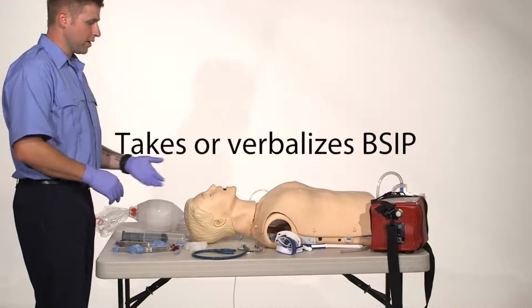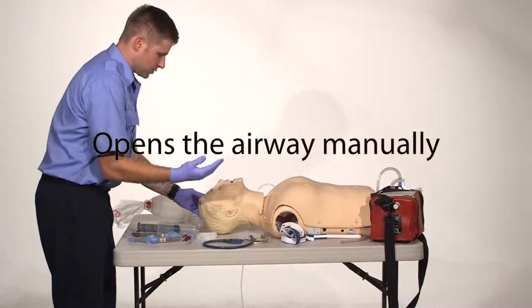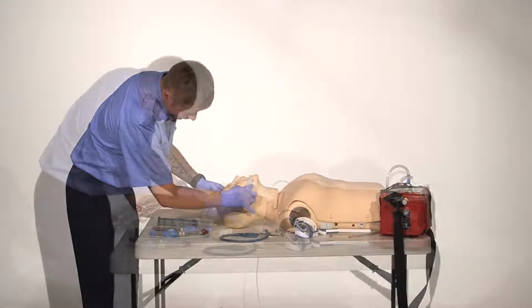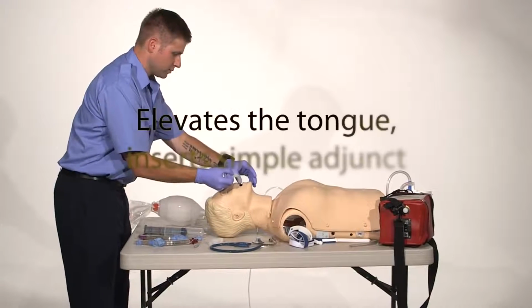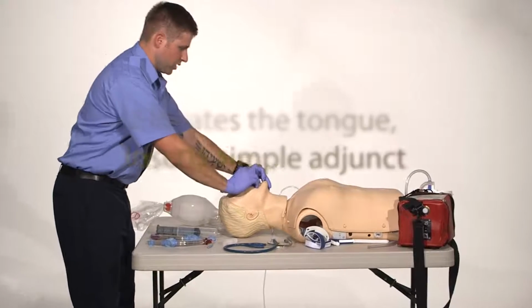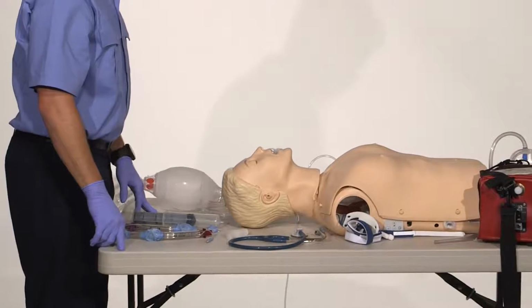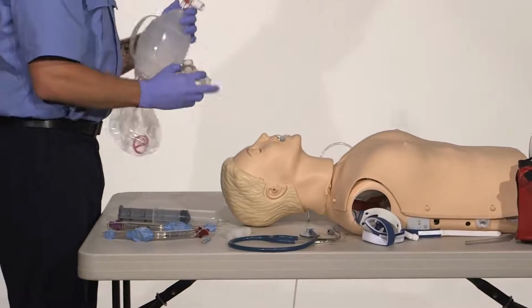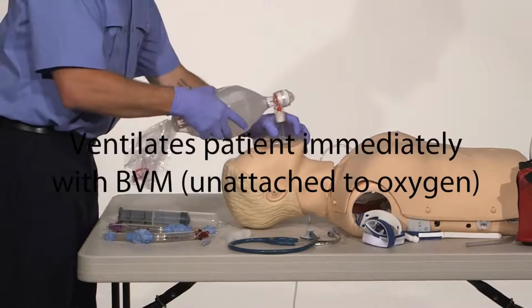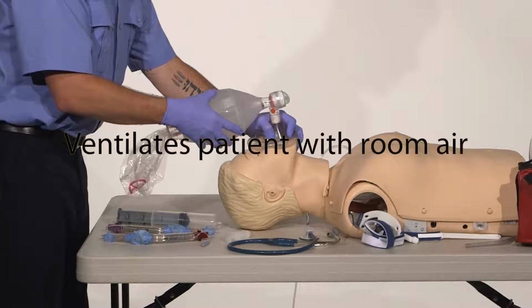I am going to manually open the airway with a head tilt chin lift. And I am going to select the proper oral adjunct, which I have an OPA here. I'm going to measure it for placement. I'm going to elevate the tongue, insert the oral adjunct. I have my OPA placed correctly. No gag reflex is present when the patient accepts the adjunct. Okay. I'm going to connect my BVM and start manually ventilating my patient.